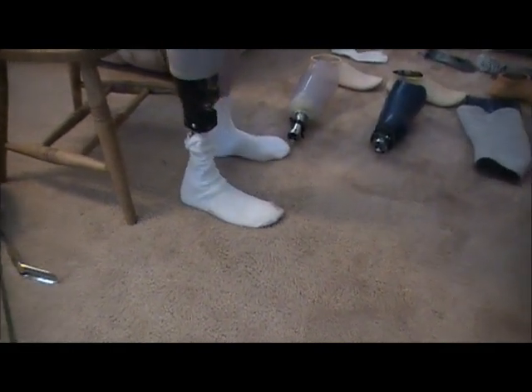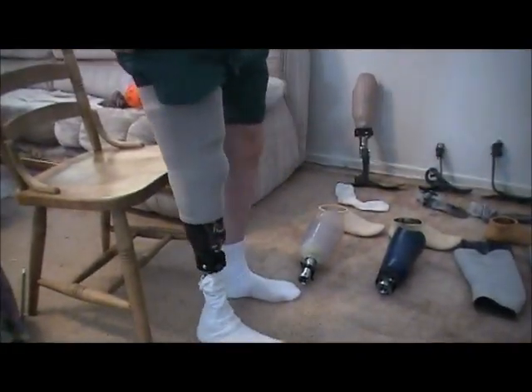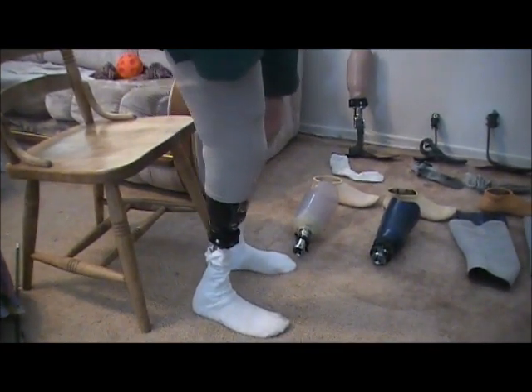This ankle articulates because of the hydraulics. This is the leg I'm currently using, and out of the ones I've tried as of right now, this is the foot I like the best.